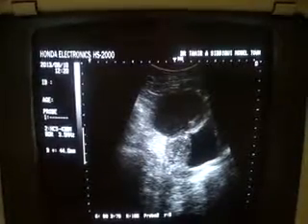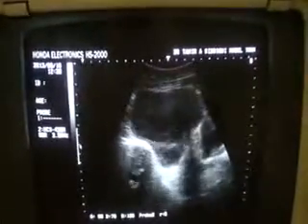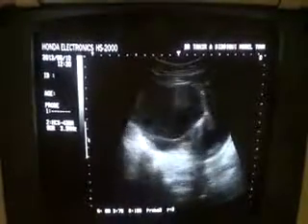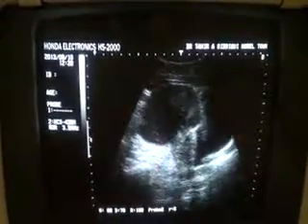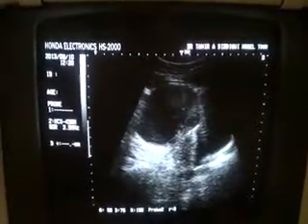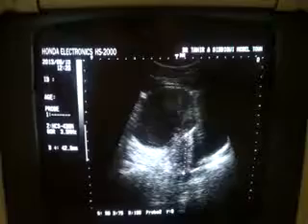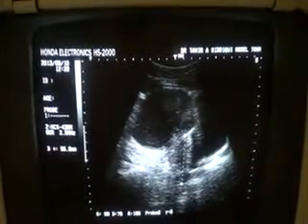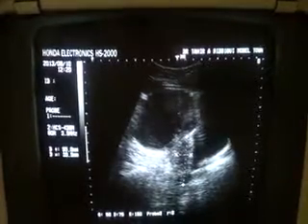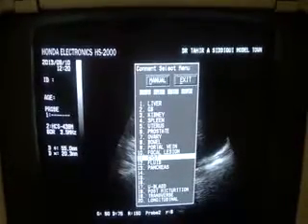Let me align the uterus with the vagina. She is an unmarried female. Now this is the longitudinal section, and in longitudinal section we see that the uterus measures 5.5 centimeters in length and only 2 centimeters in anterior posterior diameter. It is relatively small in size.